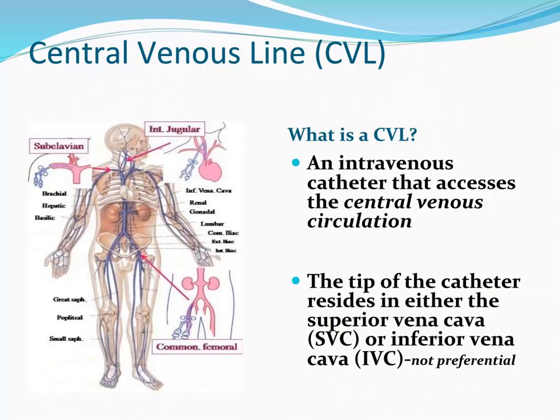The subclavian vein is associated with higher procedural safety risk, and that's why it's rarely accessed by our team. The IVC is more commonly accessed by way of the femoral vein in an urgent situation or when IJ, internal jugular access, is not feasible. Femoral lines are associated with a higher rate of infection and are placed as an acceptable alternative when necessary.